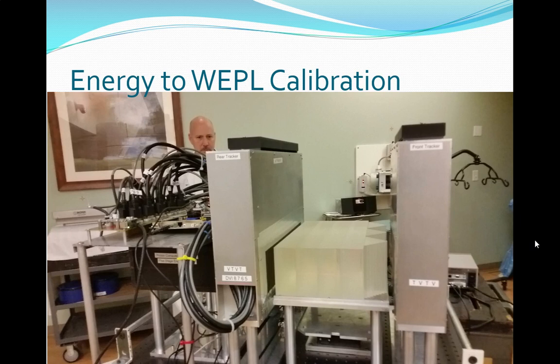So this right here is a bunch of blocks. If you notice, there's some color variation. These are blocks that you can add in. They're very precisely cut pyramids. We call them wedges. We use this for calibration.